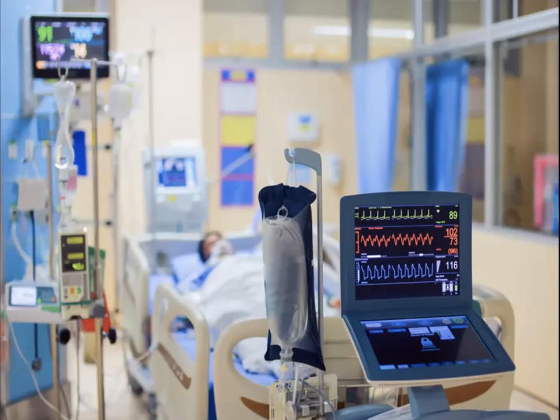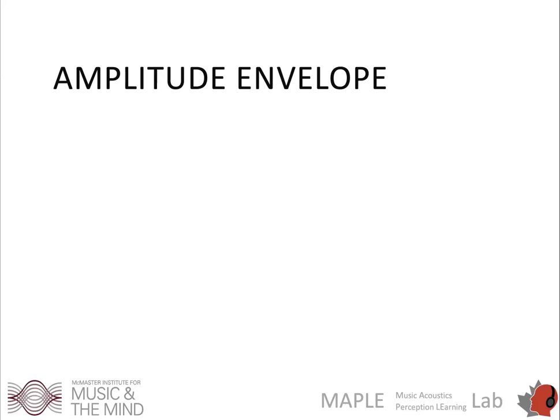Now, if that's what you're hearing, it can become very difficult for a patient to recover after surgery because rest becomes very problematic, because the sounds are often interrupting the patient. So one thing we're interested in now is: can we design these sounds in a way that can be just as communicative for the medical professionals without being so annoying and problematic for patients?